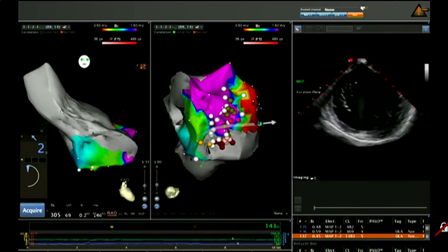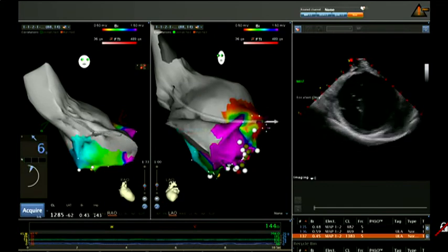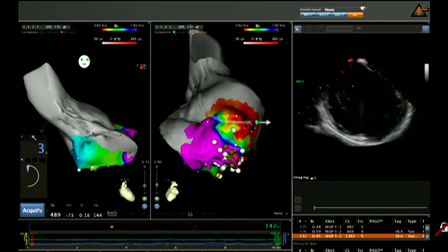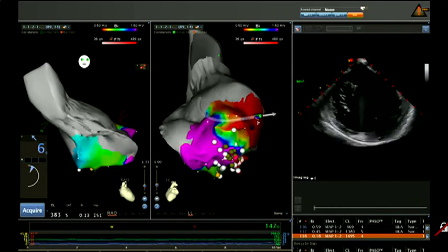Well, but you have a large scar, so you expand that. I mean, it's not like a focal. This is somebody that has a substrate that's quite large. Absolutely, that explains why different morphologies, but similar between them, are appearing.